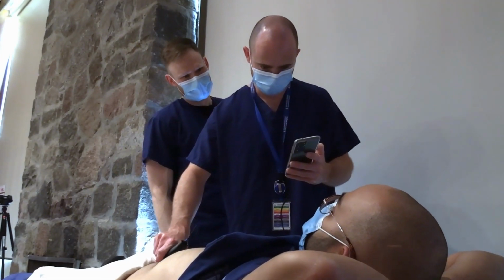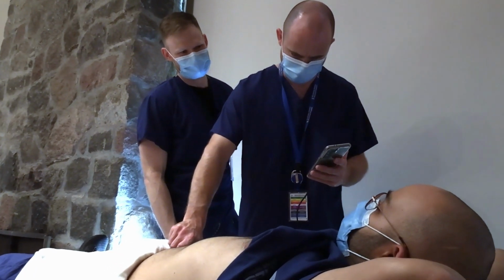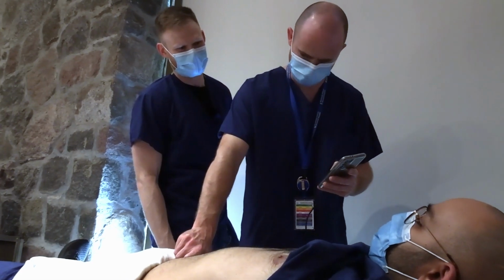The UCAT is a quick and simple evaluation that you can use at the bedside to evaluate a resident's POCUS skills. Let me show you how to use it. These evaluations should ideally happen while you're at work and seeing patients. The resident will usually select the case and find you after they've done their initial assessment. Before they use POCUS, they should come to you with the form and ask you to watch them scan.